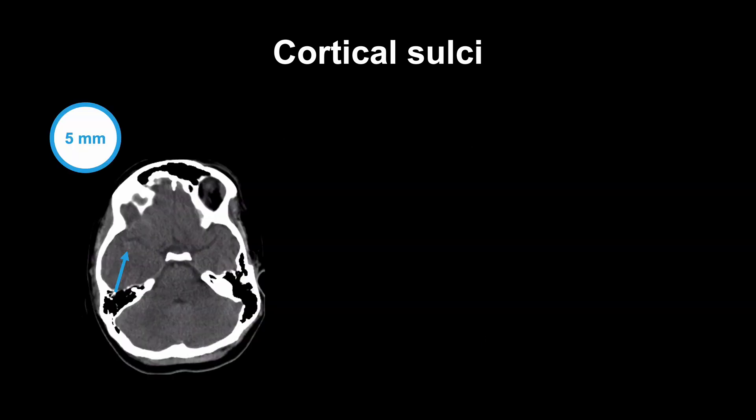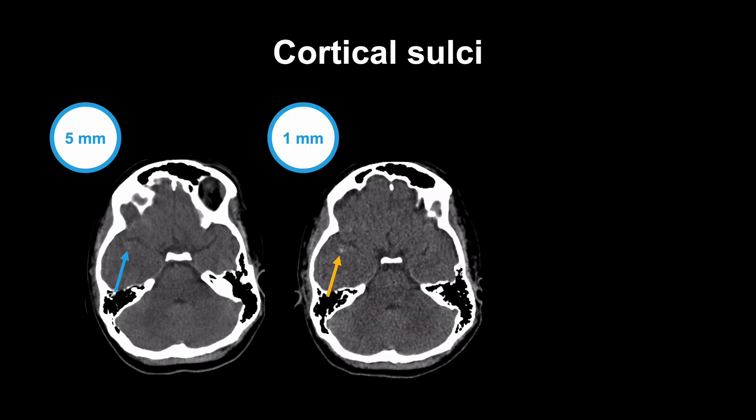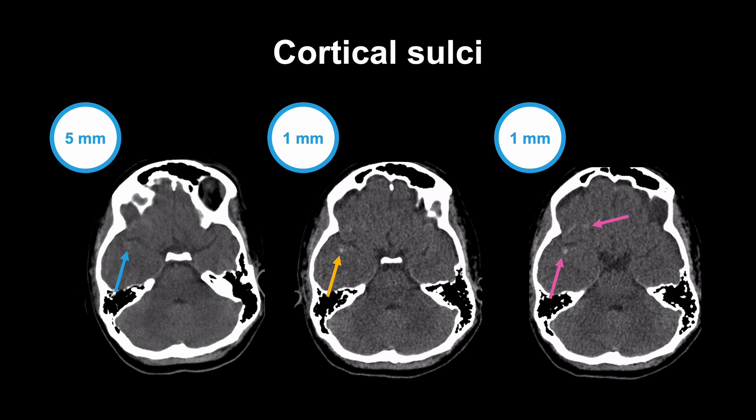Notice how much easier it is to see the small subarachnoid hemorrhage in this case when you look at the 1 mm reconstructions of the same dataset. The image on your left is the usual 5 mm reconstructions and while that is standard at many sites, it can make the high attenuation of a small subarachnoid hemorrhage less apparent than thinner sections. The middle and right images are both 1 mm reconstructions of the same data and both more clearly demonstrate the subarachnoid hemorrhage.